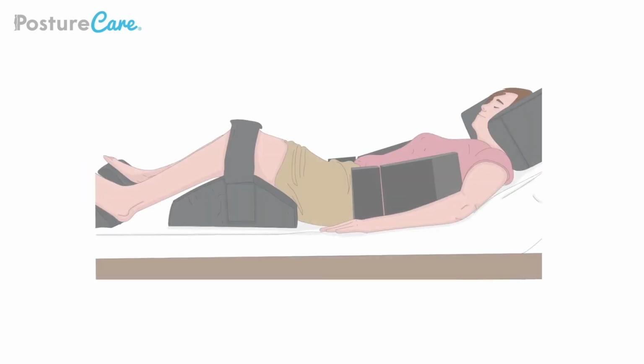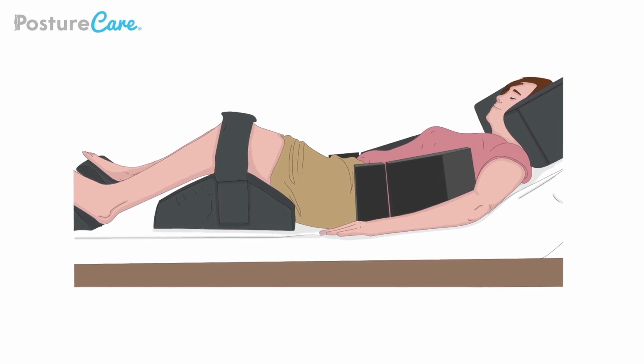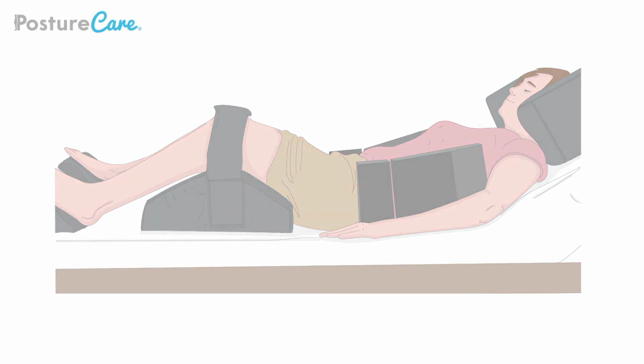Fully supported. The patient is now fully supported using the Hugga. The most optimal position of symmetry has been achieved. If your client needs to lie at 45 degrees, then please raise them after you have fitted the system on a flat bed.